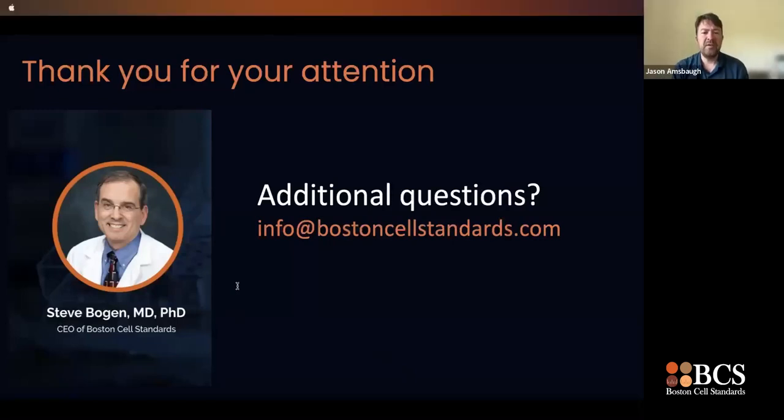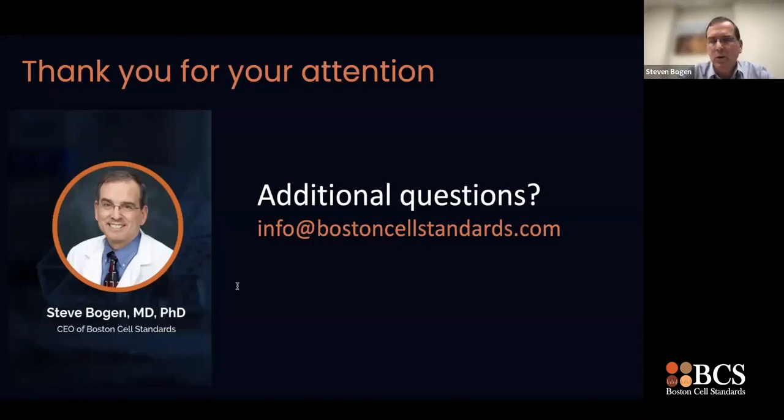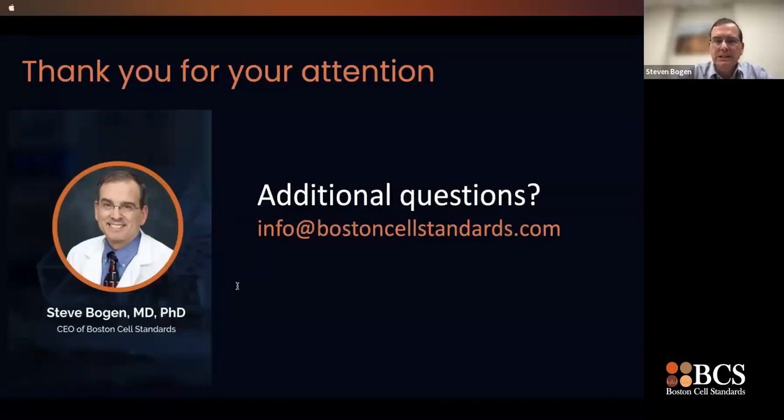Yes, thank you. The next question is, can you create calibrators and controls for novel targets? Yes, we have a process which we follow, and it really depends on what the target is. Sometimes we'll use a recombinant protein like the extracellular domain of PD-L1. It's easier if we can use peptides, because many current monoclonal antibodies used clinically were actually raised to peptide carrier conjugates. Those are easier because we can engineer them with exact concentrations of fluorochrome.